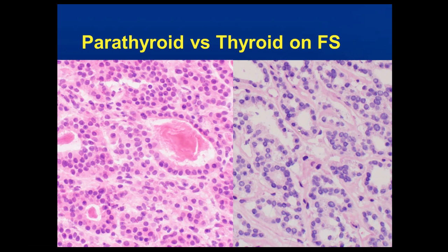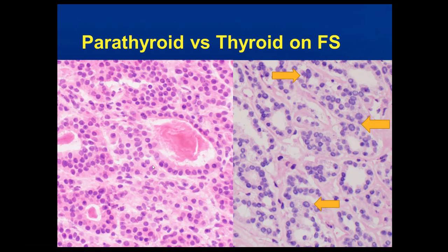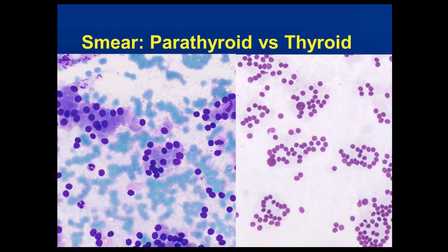So what do you do? How do you tell them apart? Potentially the nuclear features, because with parathyroid, the cells are more uniform and they're uniformly hyperchromatic. Compared to thyroid, you have a little bit more variation in sizes and shapes and a little bit more variation in the chromasia. So that's a good clue for you. You could also try a smear, and you are going to have microfollicles on both, but it might be just a touch easier for you to evaluate nuclear features, and you can see variation in size a little bit better if it's thyroid. Now, I have another clue for you.